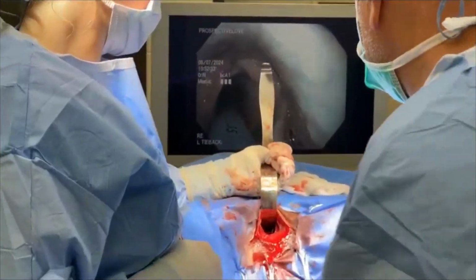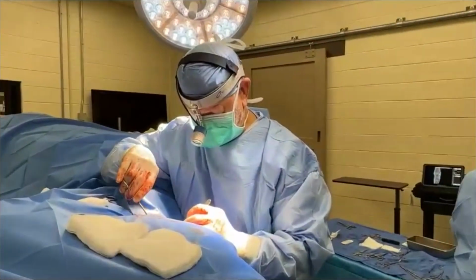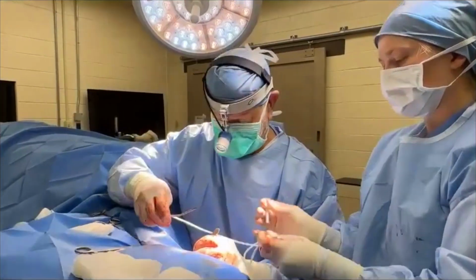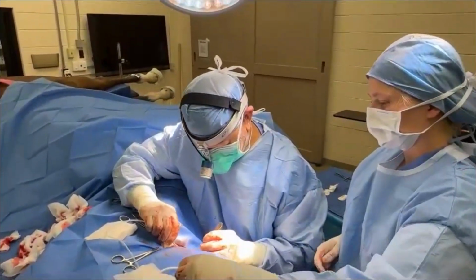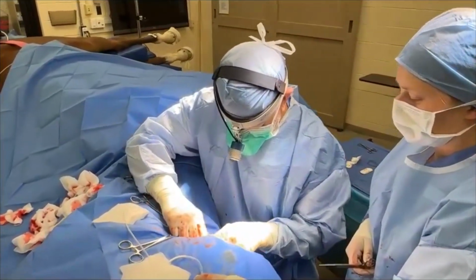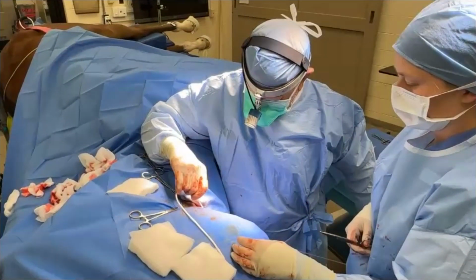other suture, what I've started doing over the last year or so, there's actually a little corkscrew with a hole in the top of it and suture that goes through that. And I've started using that in the muscular process of the arytenoid also. So it's just a little different way of doing it. I put one suture through the cartilage, and then the other one I use that little corkscrew, and then I use titanium suture buttons on the back side behind the cricoid cartilage. So there's some metal in these horses now. Generally it gives you a more stable construct if you use that.